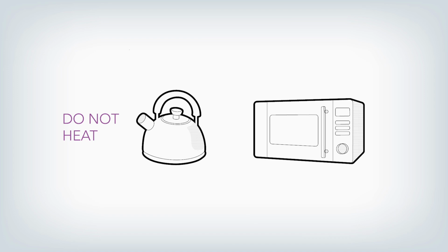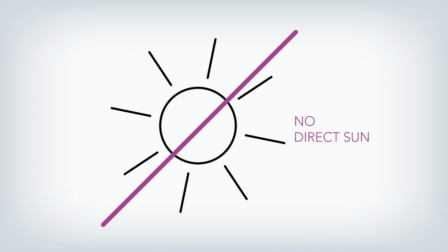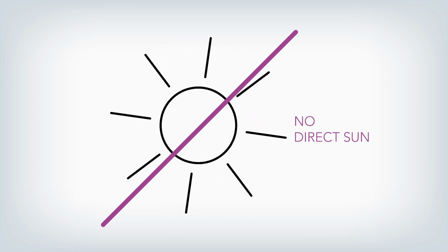As injecting cold medicine can cause discomfort and it may be difficult to depress the plunger, remove your prefilled syringe from the refrigerator 25 to 30 minutes before taking the injection. Do not warm the prefilled syringe in any other way, for example in a microwave oven or in hot water. And do not leave the prefilled syringe to warm up in direct sunlight. Speed warming the device may destroy the medicine.